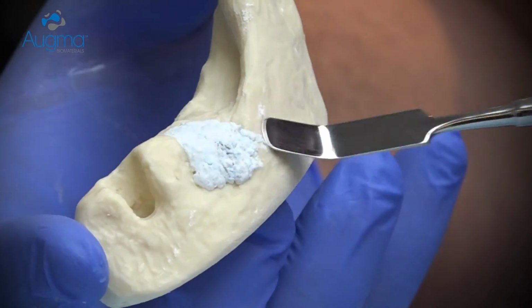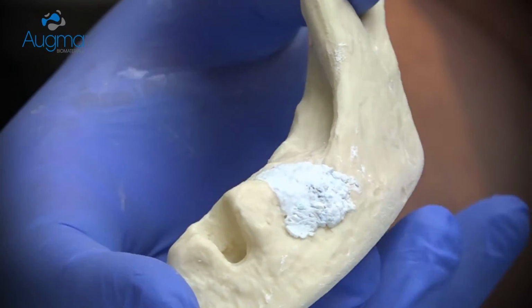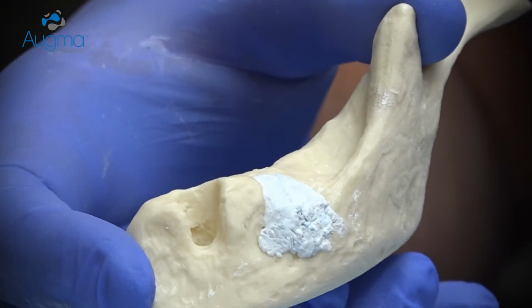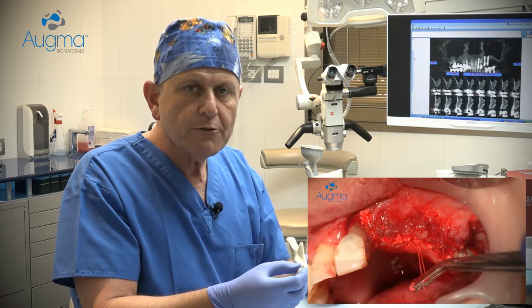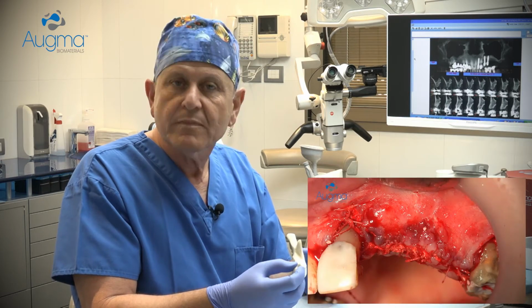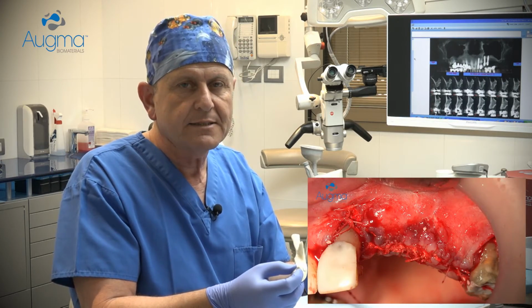If you need to shape, you can shape it a little bit and press it again for 3 seconds and you can close the flap. However, it's very important that your soft tissue will be primarily closed and well sutured. That's all, simple as that.